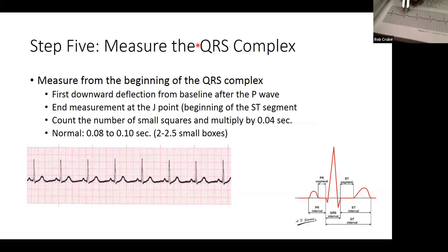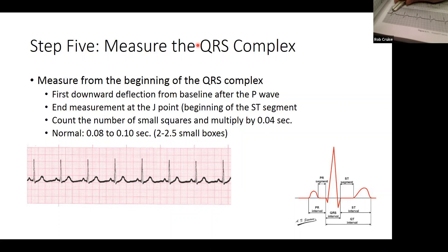For the QRS complex, we measure from the deflection on one side to the deflection on the other side — the J point. Counting the small squares within the large boxes, we get two and a half squares, which equals 0.10 seconds — the upper limit of normal. So this strip reads as a normal sinus rhythm at 60 beats per minute, with a PR interval of 0.14 seconds and a QRS of 0.10 seconds.